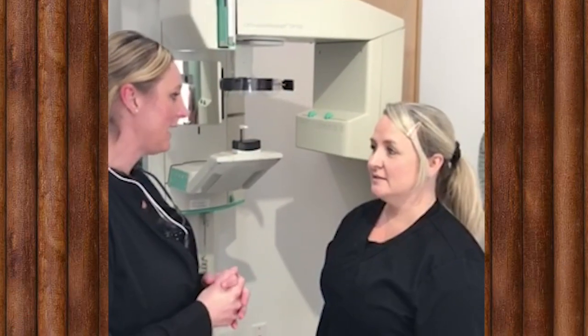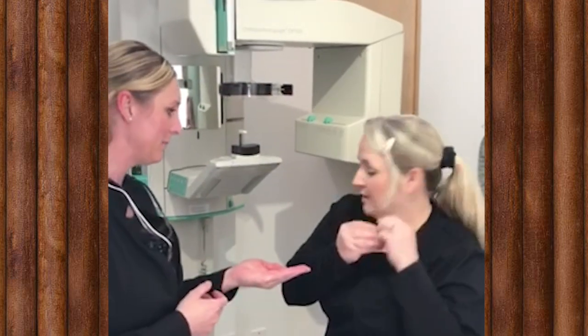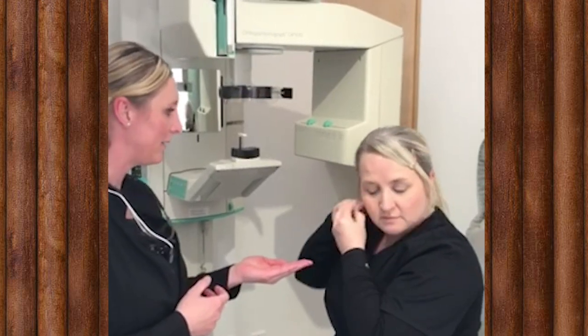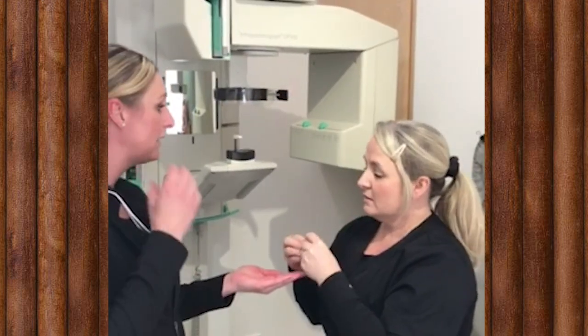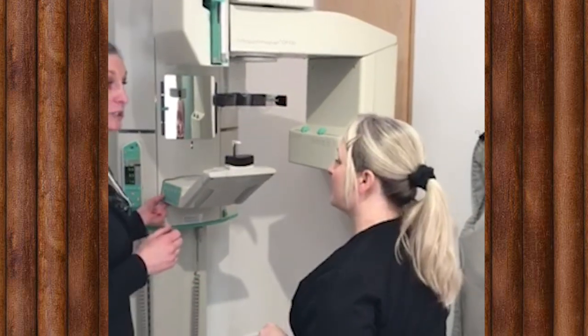We are going to take a pano today, and I'm going to need you to remove your earrings — I'll hold onto them. The reason why we're going to do a pano is because it helps us see any abnormalities in the jaw area, wisdom teeth, and anything that we wouldn't be able to see with other X-rays. Okay?